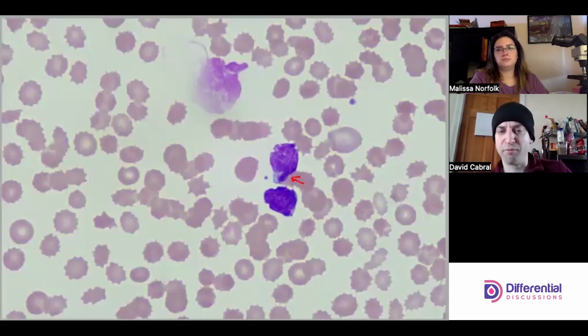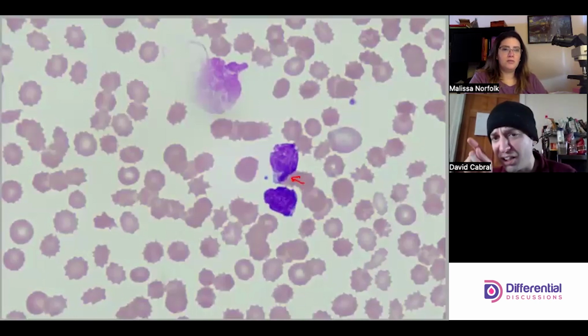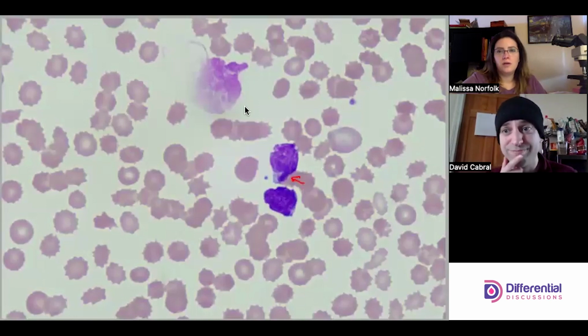That's abnormal. Although you want to be careful about making a judgment, especially in a vacuum, when a cell's being pushed and kind of pulled. But I don't like that personally. I don't like the little almost vacuoles in the nucleus in that cell as well. That I find really troubling.